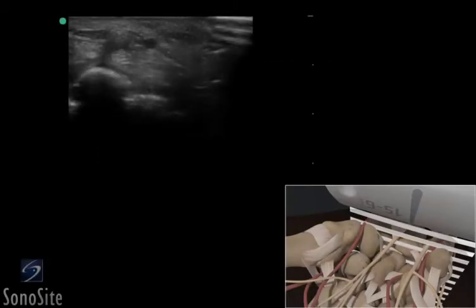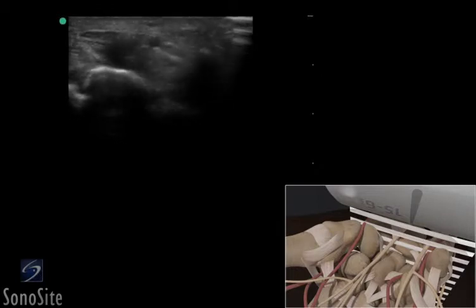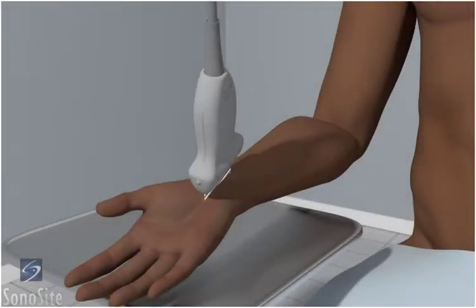A linear array transducer with a musculoskeletal exam type is used to perform an ultrasound examination of the ulnar nerve. The patient is in a sitting position with the arm flexed and the hand externally rotated.